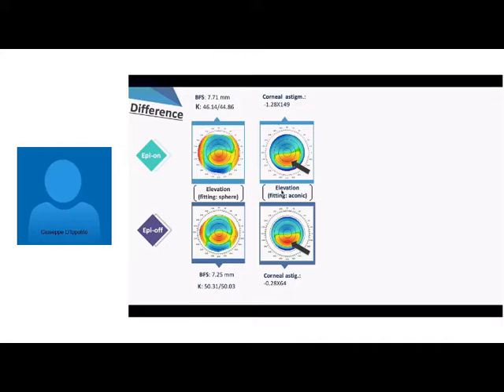Well, how come it's smaller on the stroma? It's because there is definitely much more coma here. So much more astigmatism was fitted into coma on the stromal side, and some of the coma turned out to be astigmatism after epithelial remodeling.